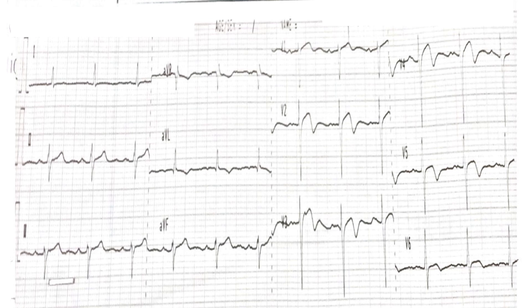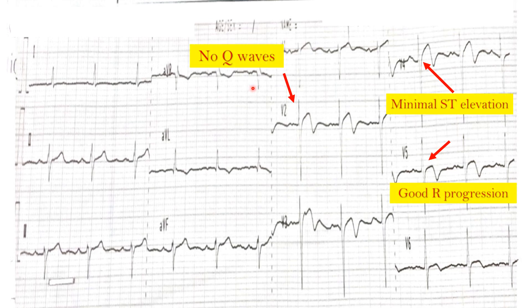Applying this to our ECG: there are no Q waves in leads I, V2, V3, V4, V5, or V6. There is no ST elevation to suggest anterior wall MI — only very minimal ST elevation that does not meet the criteria; this is more of a J-point uptake. The R wave progression is good and healthy. Our ECG meets all three criteria — this is classical Wellens Syndrome with biphasic T waves.